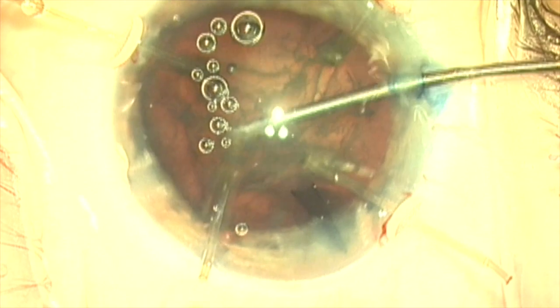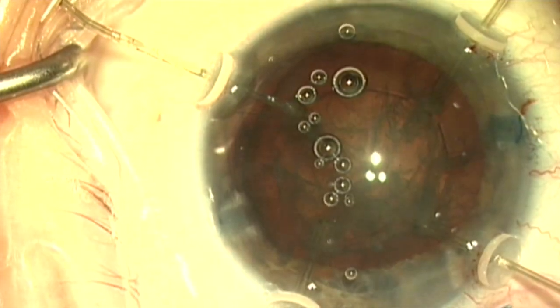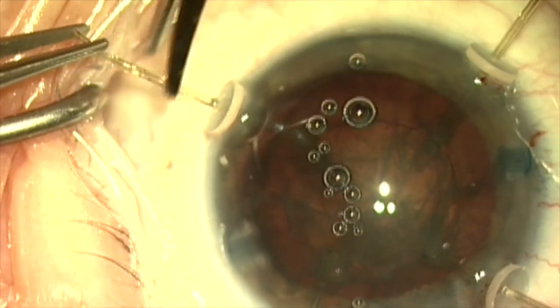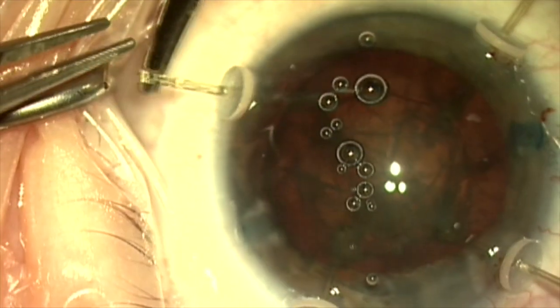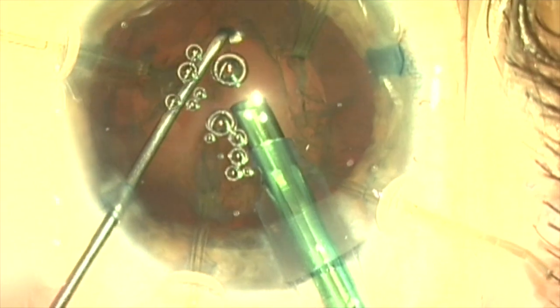When I cinch these capsule retractors up, I don't want to make them too tight — just tight enough to provide support. Here this retractor looks like it might impinge on the lid, so I'm going to amputate the end of it so that it's less likely to be disturbed by the lid or the speculum.